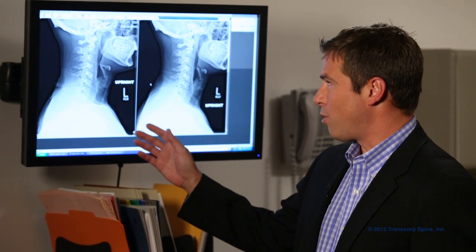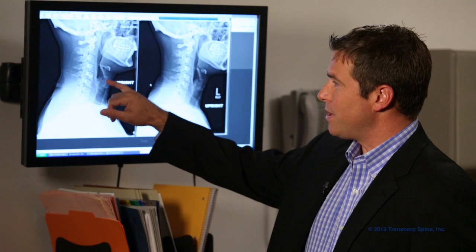This is the x-ray at the four-week mark following his operation. You can see the disc height of C5-6 is comparable to the adjacent segments, C4-5 and C6-7, where no surgery was performed. There's been no loss of disc height. The alignment of the spine is anatomic and there's no indication of subluxation or bone spurs.